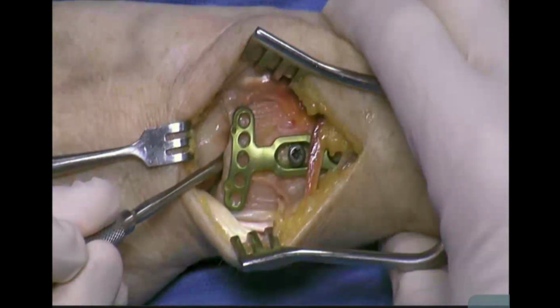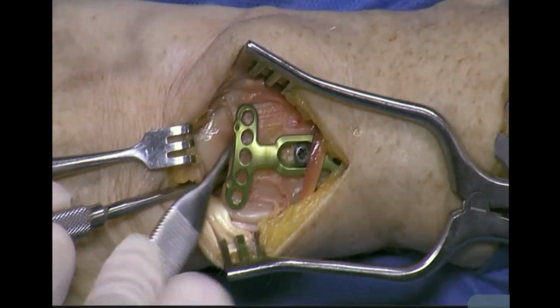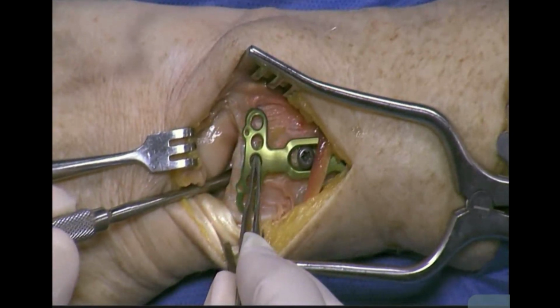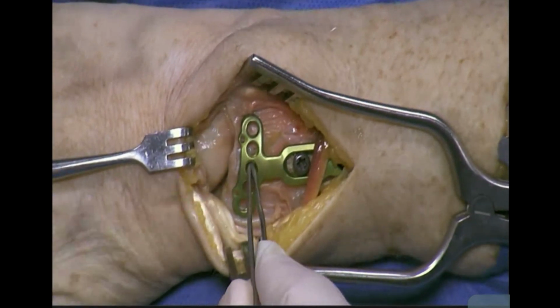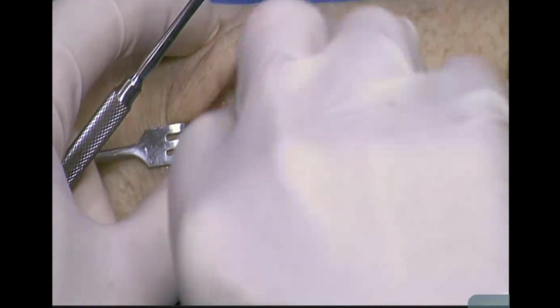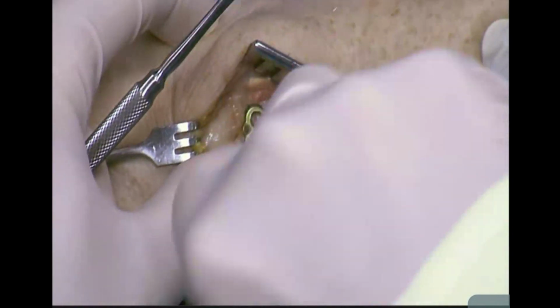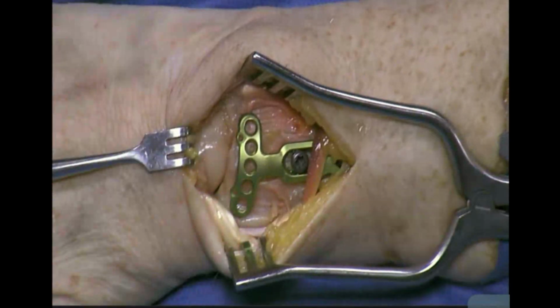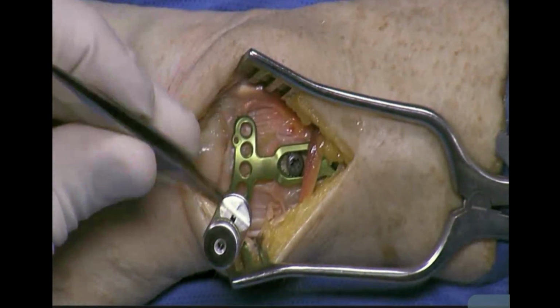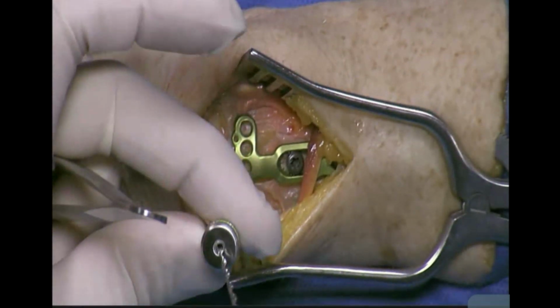So again, we can inspect our fracture site. Remember, the articular surface is always curving away from us just a little bit, away from this ridge. And I want these screws to be able to come down right in the subchondral bone. So something in that neighborhood looks pretty good. So once I'm happy with the position distally relative to the articular surface, I'm going to buy that position and secure that screw. And let's go distally now. And all these screws are designed to go down roughly parallel. So in effect, this is going to give us a platform made of screws directly in the subchondral bone.